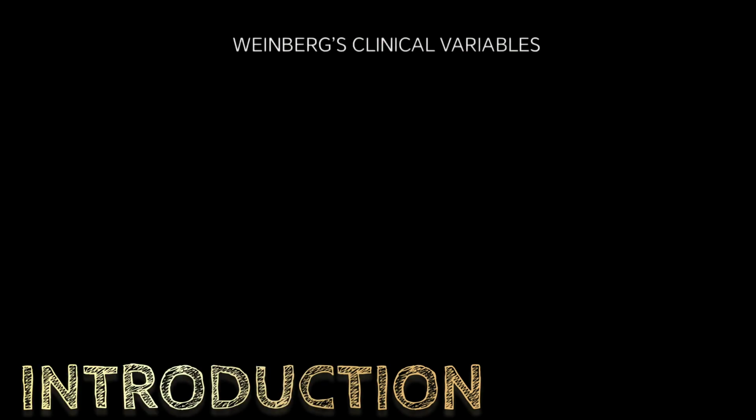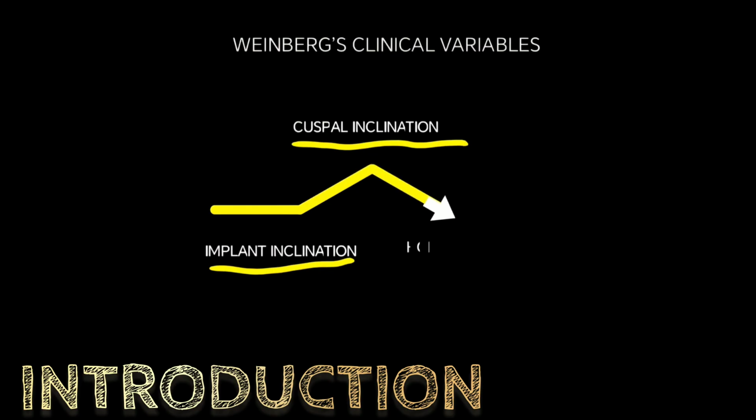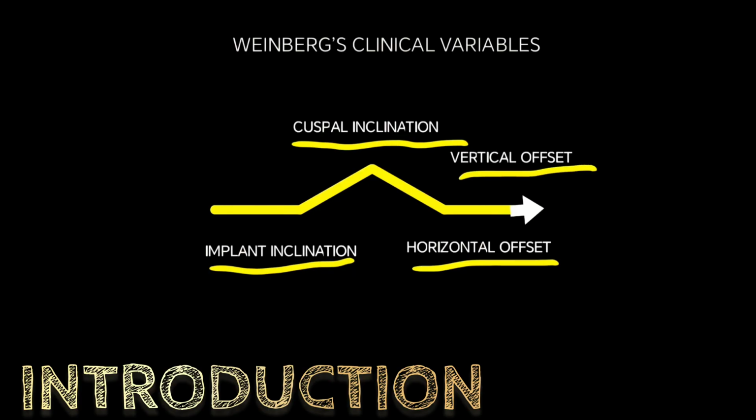The clinical variables affecting the implant prosthesis loading are: the first is the implant inclination, the second is the cuspal inclination, the third is the horizontal offset, and the final one is the apical or the vertical offset.